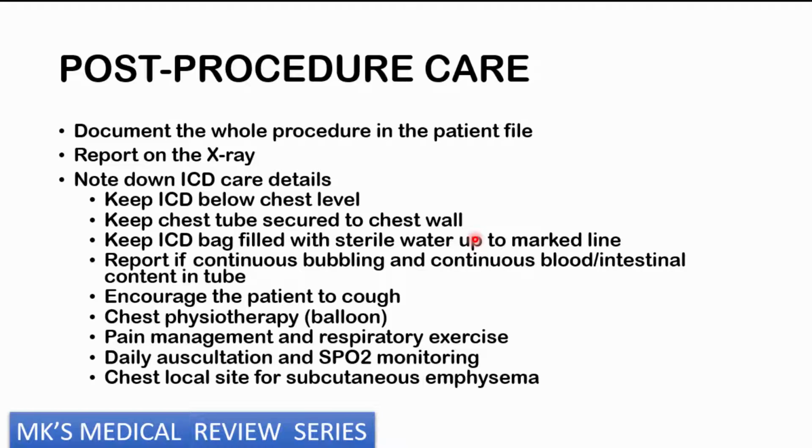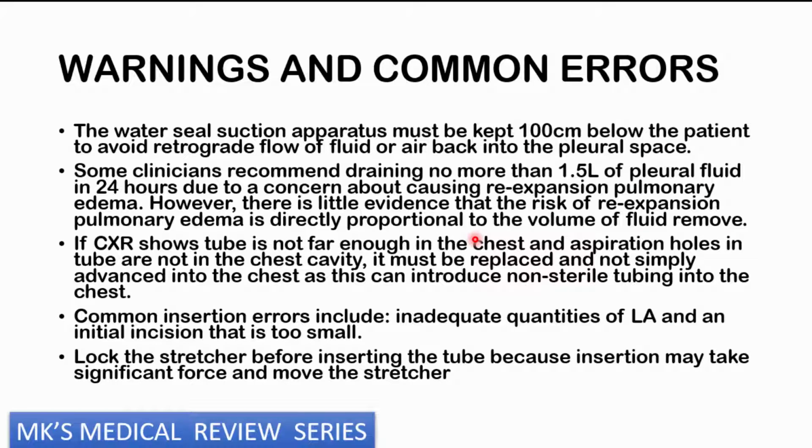So this increase in the pleural pressure is going to be forcing whatever is in the pleural space to exit through this ICD. Then, of course, you should also offer some pain management and respiratory exercises, daily auscultation of the chest, monitor the oxygen saturation, and of course, check the local site for presence of subcutaneous emphysema, which is air in the subcutaneous tissue.